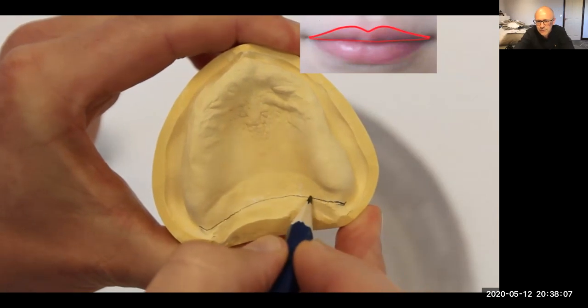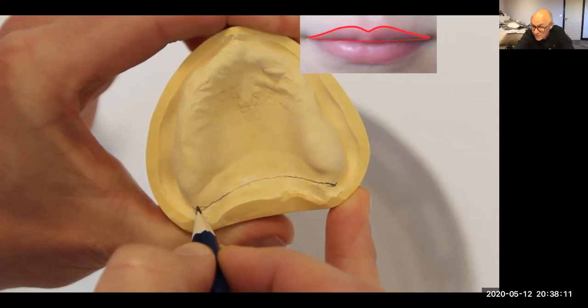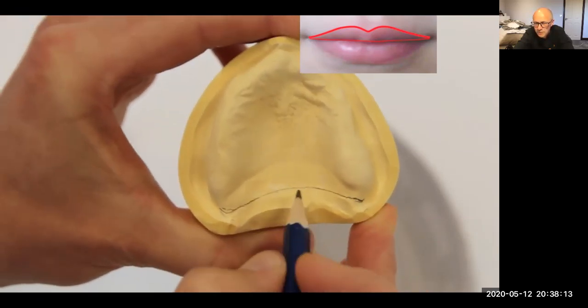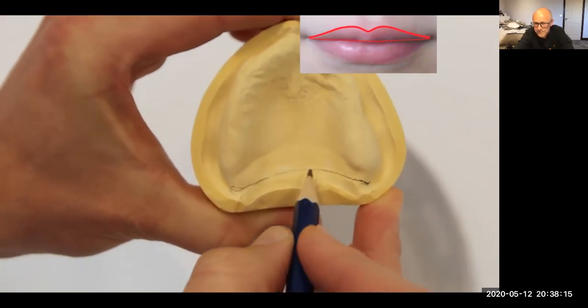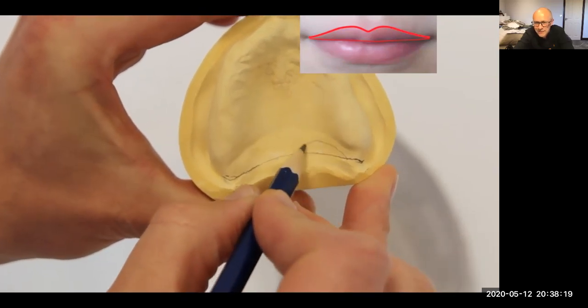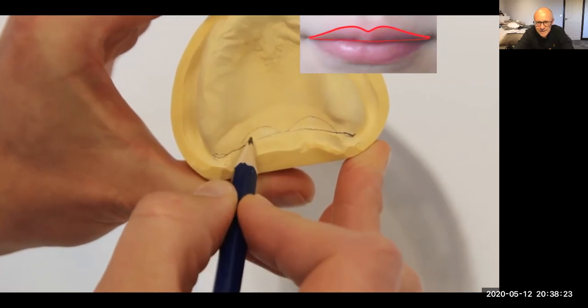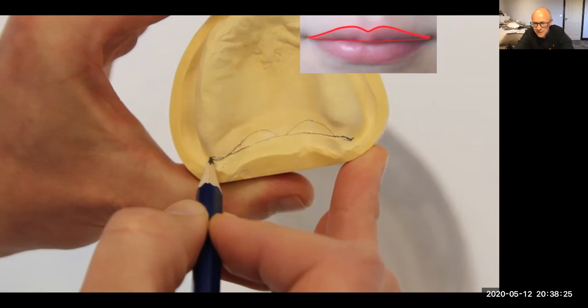So I draw with a pencil where I want it. And I've looked in the mouth to see where the fovea palatini are. So right in the middle, I've taken it across. And then I'm going to draw it into where the connective tissue is here. So these are the soft bits just there.